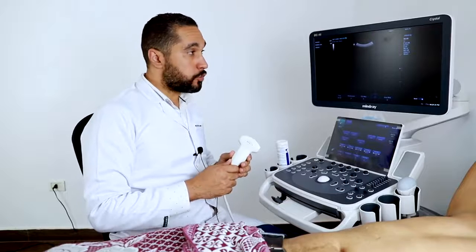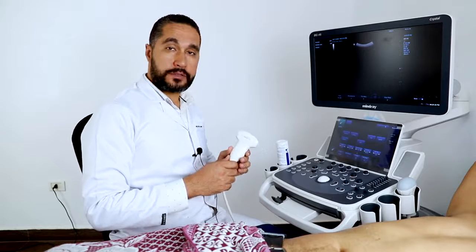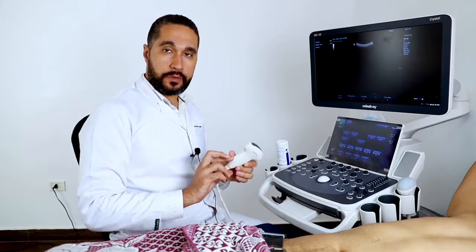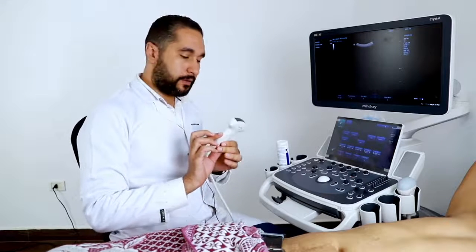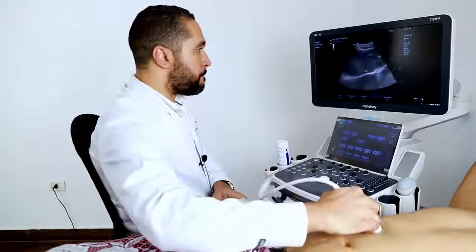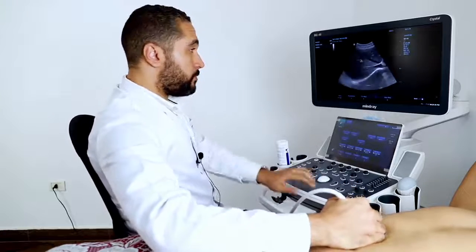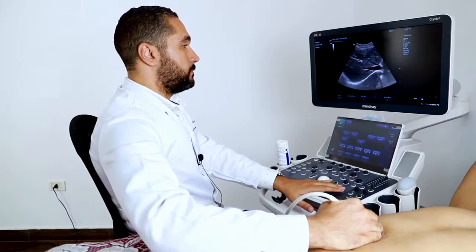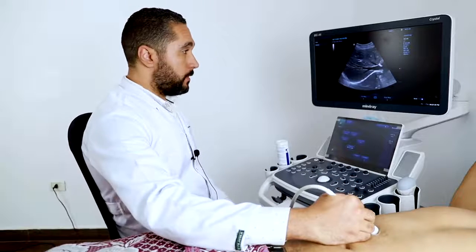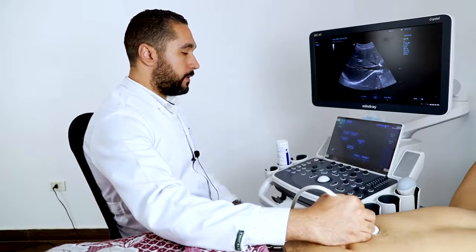Now I'm going to show you the single crystal convex probe in the DC40 Crystal. We're going to see the liver and the good resolution of the single crystal — how it gives us good penetration and less noise with good resolution. This is the liver and this is the hepatic vein.